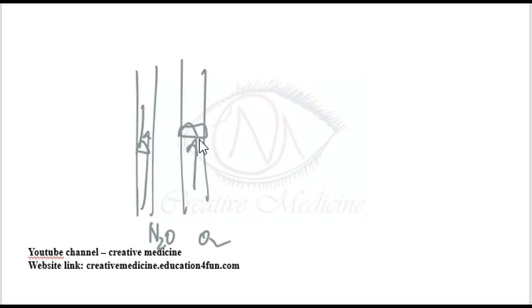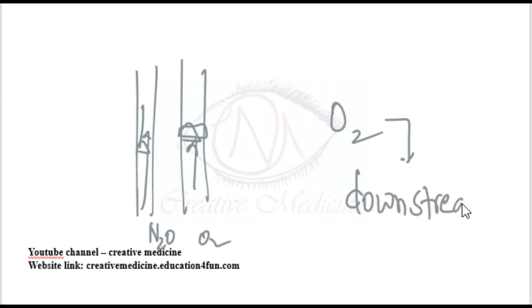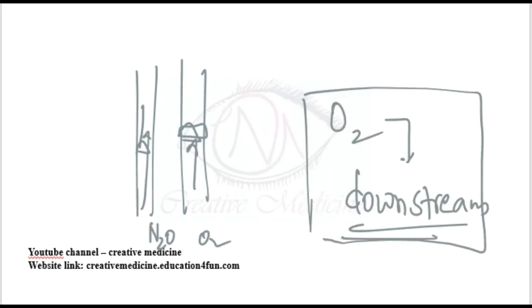That is hypoxia guard. So this flow of oxygen in the modern anesthesia machine is in the downstream, that is to the patient, down the pressure gradient. Here downstream means the direction toward the patient. So this is about the anesthesia machine.